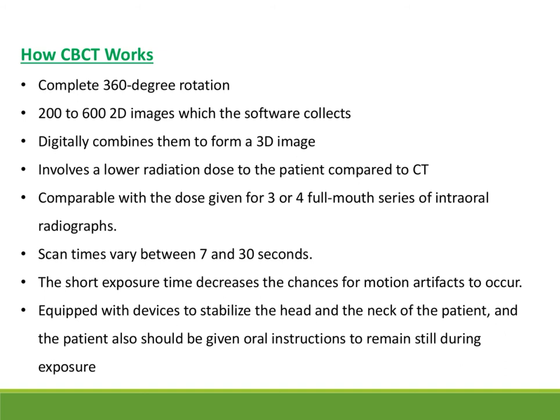Equipped with devices to stabilize the head and the neck of the patient, and the patient should be given all the oral instructions necessary to remain still and to remove all the removable appliances from the head and neck region. The patient positioning is the same as your panoramic imaging. The spine should be straight. The mid-sagittal plane should be straight or parallel to the receptors.